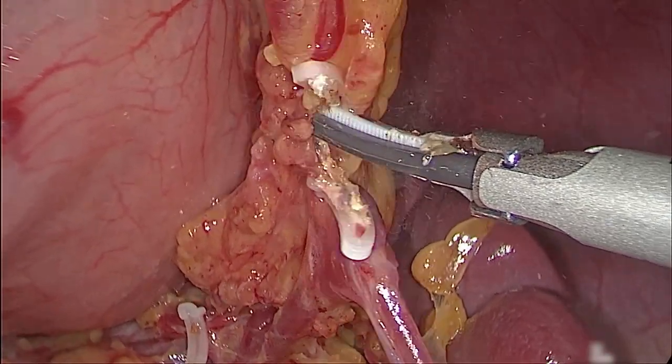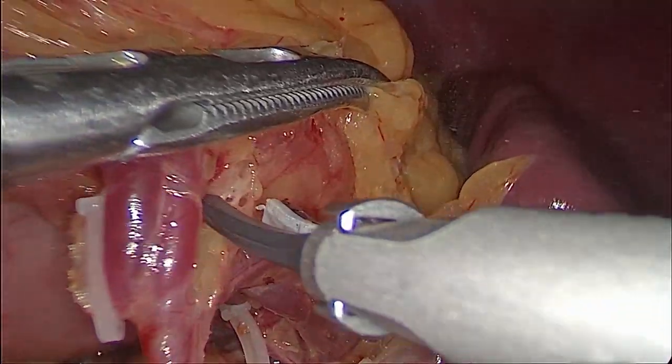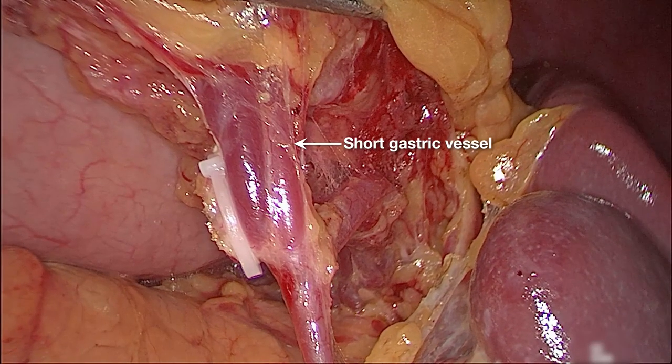We divide them at their roots. This is the short gastric vessels.